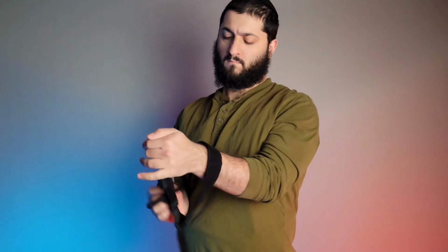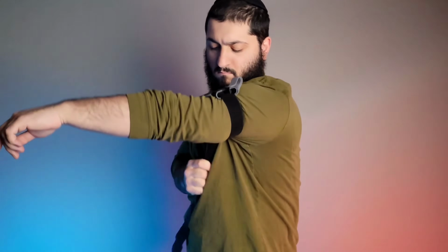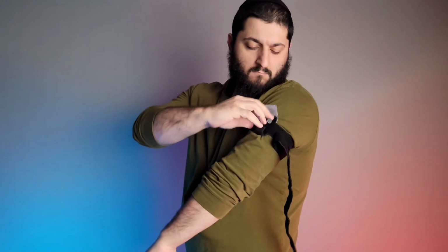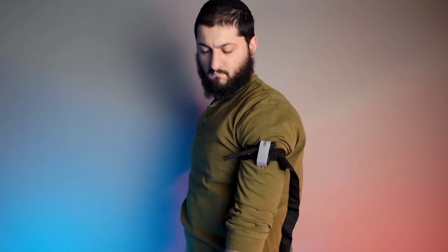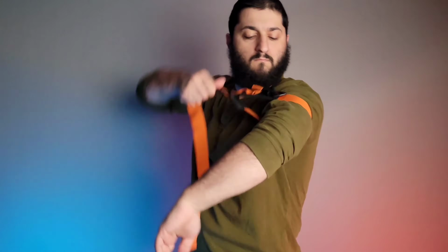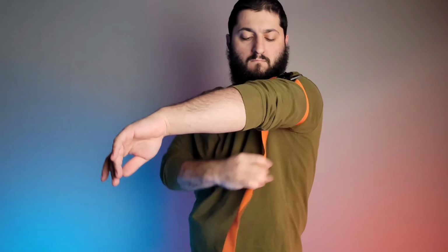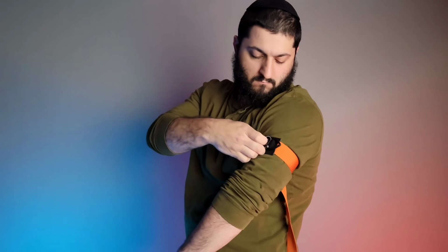Now, all these tourniquets were also self-applicable. So this is how it came from the factory. This is what it came from North American Rescue. And when you wrap it, it's easier to do it single-handed and to apply it to someone else. Same thing with the SOF T Wide. They were able to be applied single-handed or to someone else very simply. But again, in regards to having function and size, these were just not able to cut it.